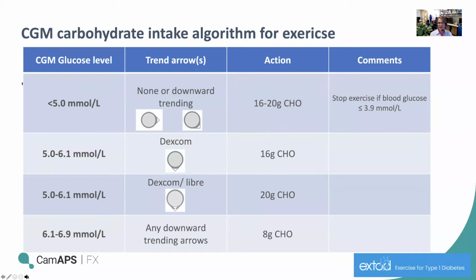Okay, and we said earlier about thinking dynamically. There's no two sessions the same. What drives people mad, people tell us, is that they go to the gym, they do the same thing, one time it works, one time it doesn't work. So we encourage people to take each session as it goes. And some people might find this helpful. It might be going into the nitty gritty too much.